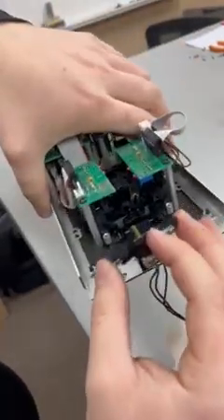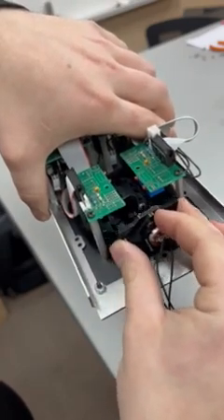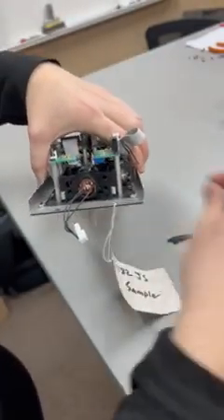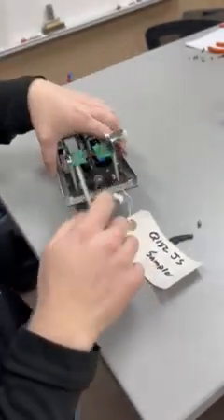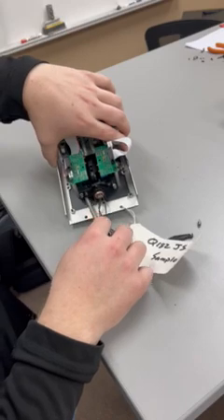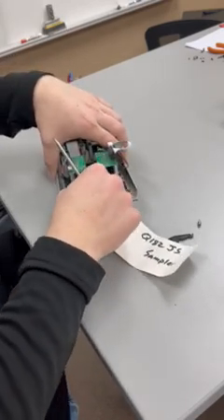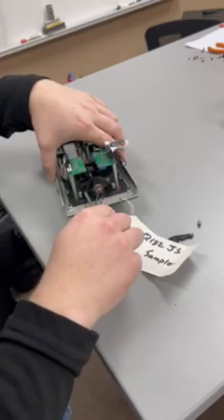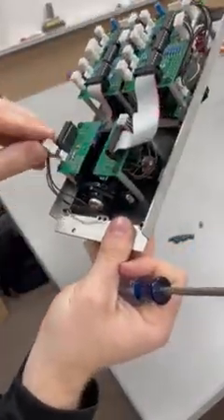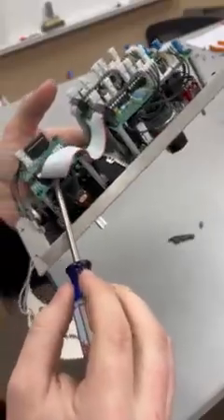For reassembly, just take this and pop it right back into place. Take your two brass screws and reinstall. Then plug your MTA connector right back in.